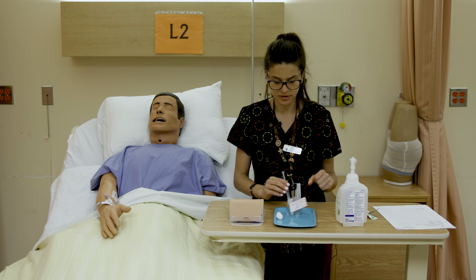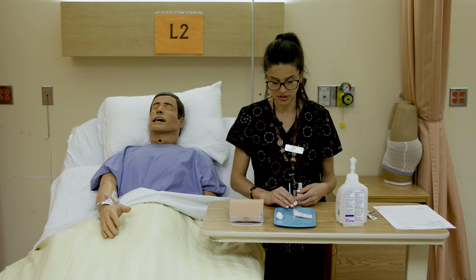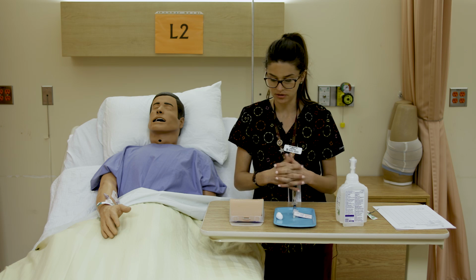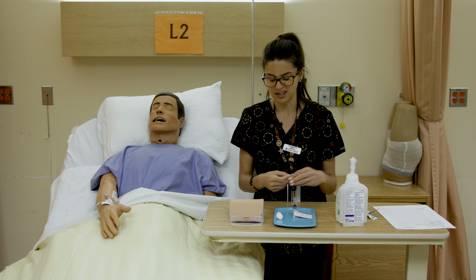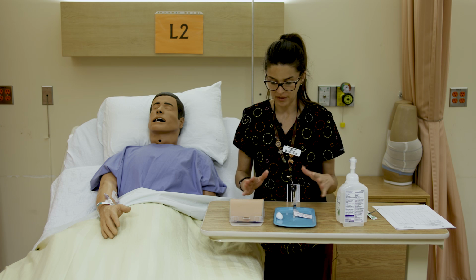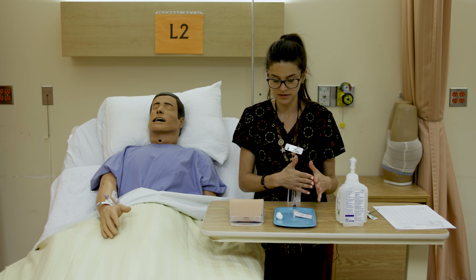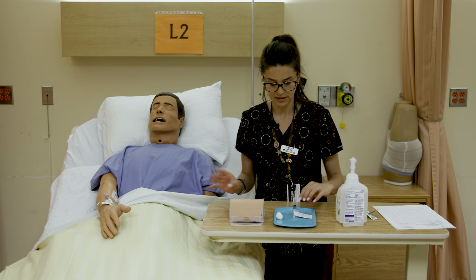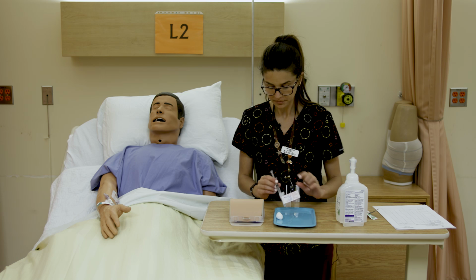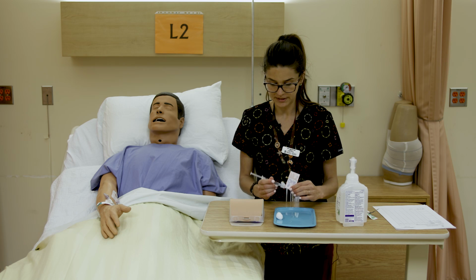Just a quick note with aspiration: you probably noticed that with subcutaneous injections, we don't aspirate. You're not required to, and you shouldn't aspirate actually, because it can increase the damage to the tissue, and there's a really low risk of hitting a blood vessel with subcut injections. So just note that difference. We only do that with IM. Our alcohol is now dried, so we're going to go over Z-tracking.